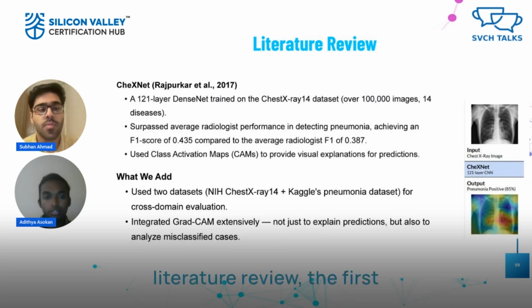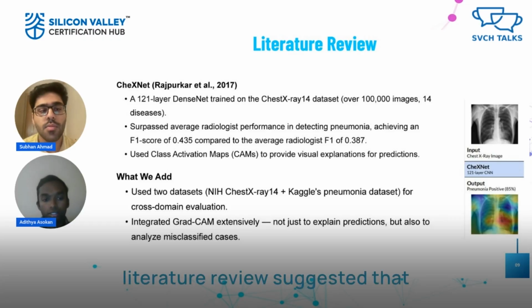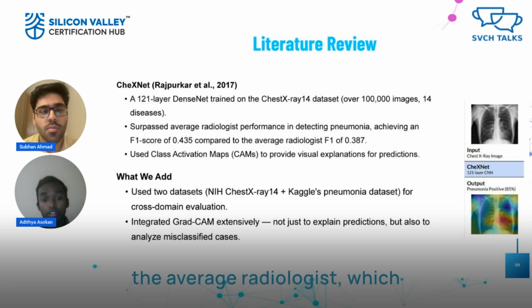Based on the first literature review, we saw that many images were trained on the DenseNet model, and one of our literature reviews suggested that it surpassed the average radiologist's performance in detecting pneumonia. It achieved an F1 score of 0.435, which means they had higher true positives compared to the average radiologist, who had a lower F1 score.